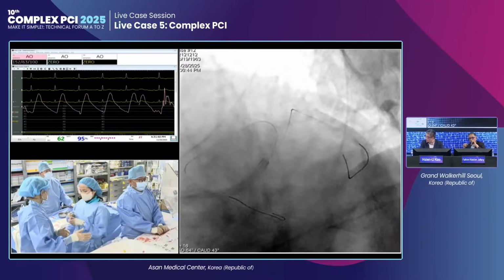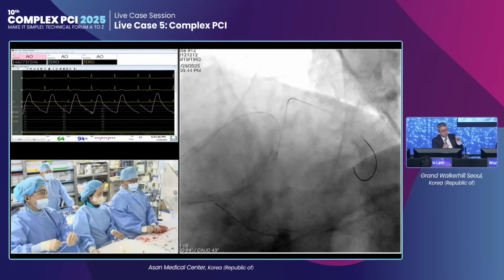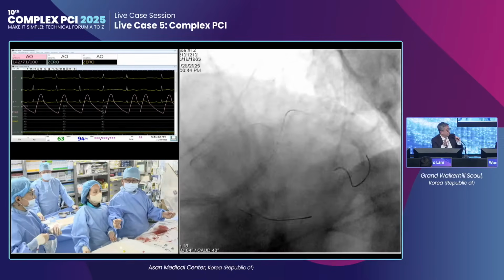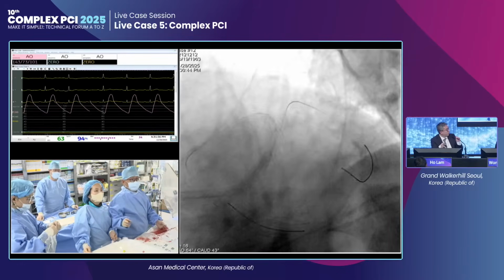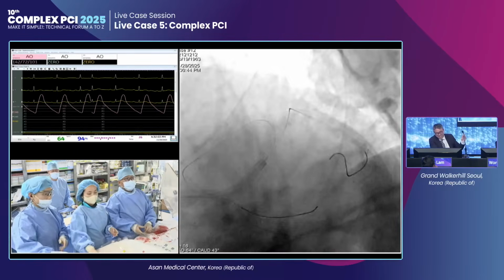Recently, I heard about a concept for these bifurcation lesions, because of negative remodeling and some angulation. Some operators suggest a kissing balloon technique. Could you give me... So I mean kissing in over here. Do you think this will help? Kissing and then LAD, change the anatomy.